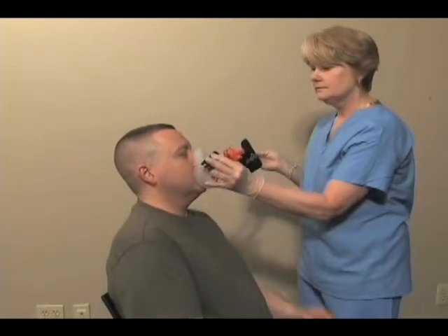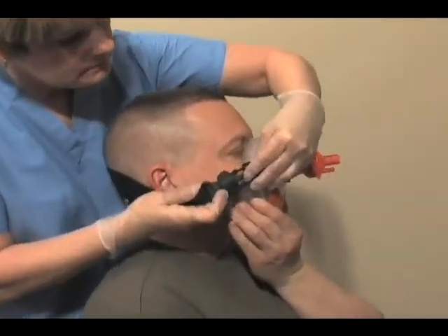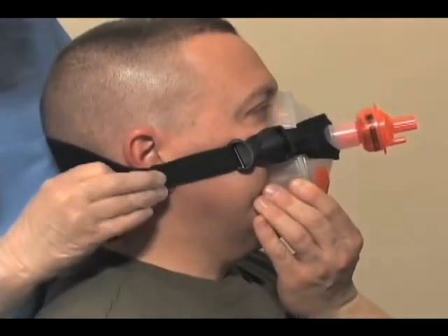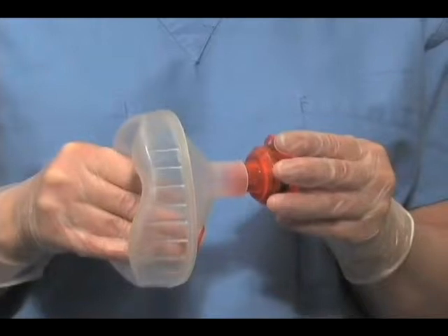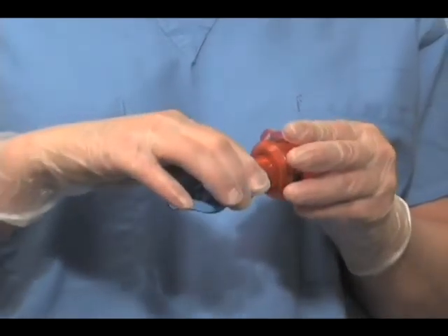Instruct the patient to place the face mask on their face and maintain a tight face mask seal. They should breathe normally at a rate of 10 to 16 times per minute and inhale slowly over 2 to 3 seconds per breath. An optional head strap is included to help secure the mask and maintain the tight seal that is important for providing the ResQguard therapy. If the face mask is not tolerated, the ResQguard can be used with a mouthpiece.